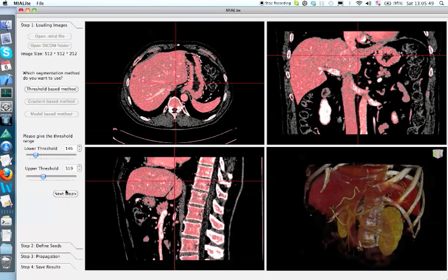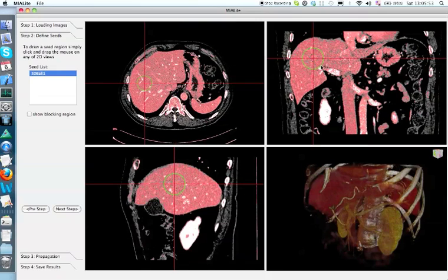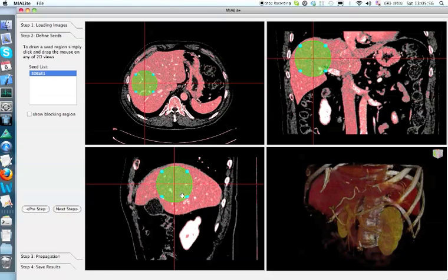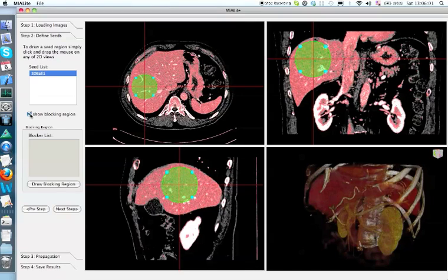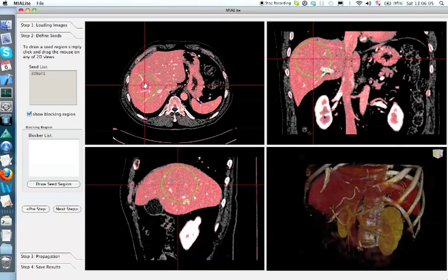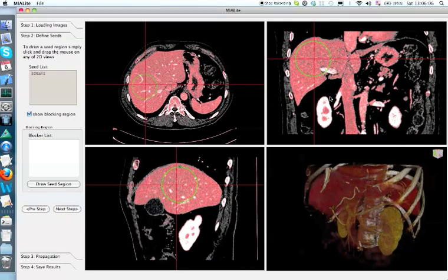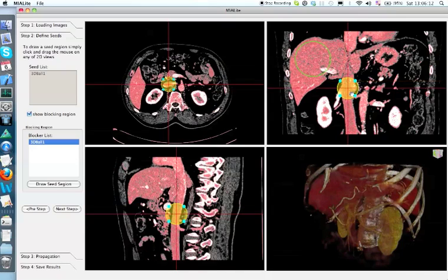There might be holes, but we are going to use curvature to go over that. It is easy to set the seed region, but there are some areas of liver that might cause leakage. First of all, the big veins, the vena cava and the portal vein, we definitely want to put some blocker to prevent the leakage from that area.